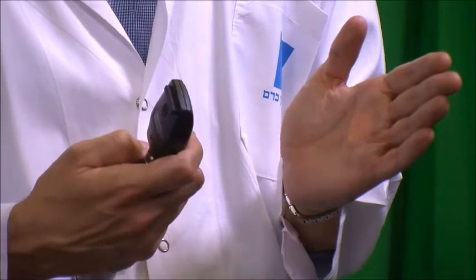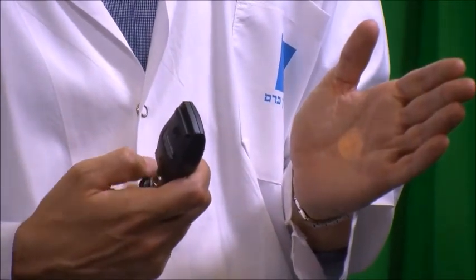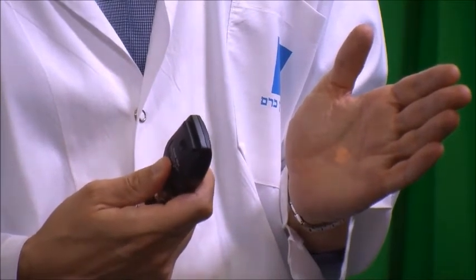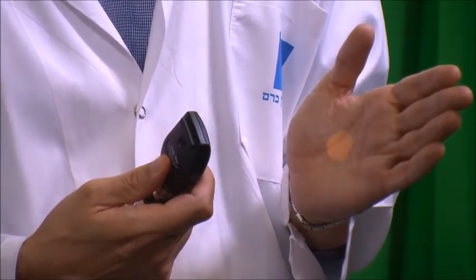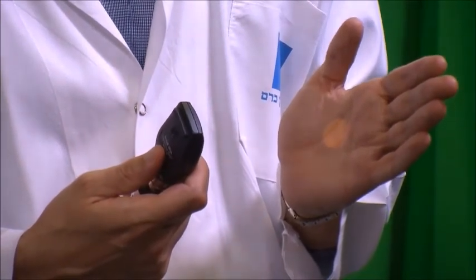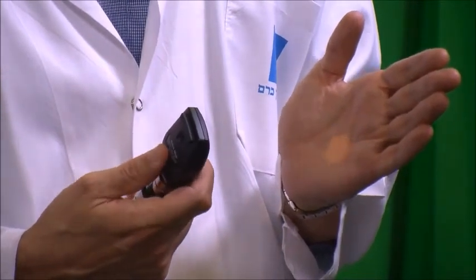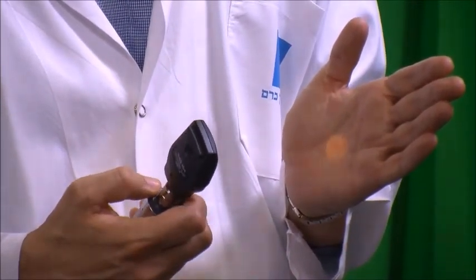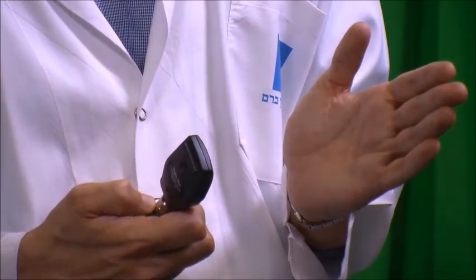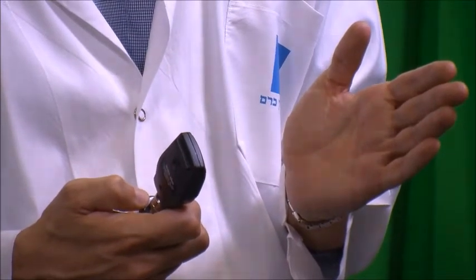Okay, I've turned on my direct ophthalmoscope and I have a circle of white light here. The ophthalmoscope has different settings, but it's the circle that I'd like, and you have different sizes of circles. It's believed that it's appropriate to use a circle that's small enough to match the patient's pupil size. So I have my circle set up. The next thing I'm going to do is reduce my intensity of the light to the bare minimum until I can see it. This is very important to keep the patient comfortable and not to use more light than you need to.